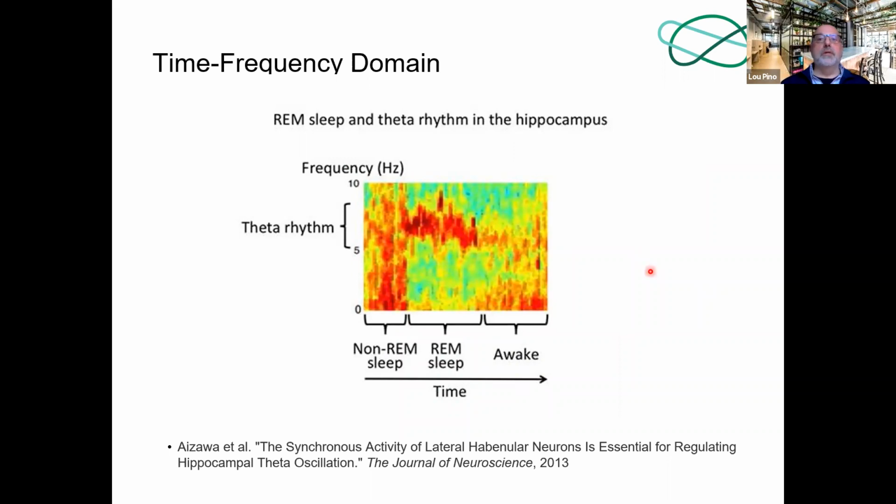Each color represents the power of the detected signal. So one pixel is the power of the voltage at a particular epoch in time at a specified frequency. The y-axis is frequency and the x-axis is time. Higher numbers on the y-axis are faster oscillations, that is higher frequencies. And colors closer to red mean that the amplitude of the signal is stronger.